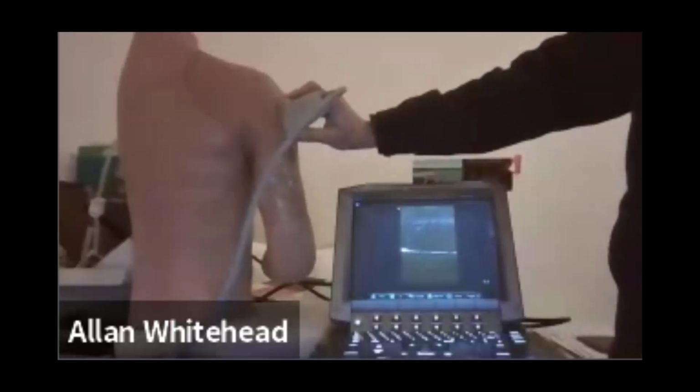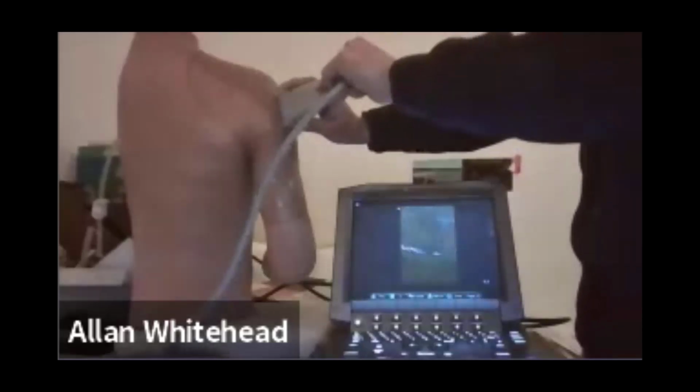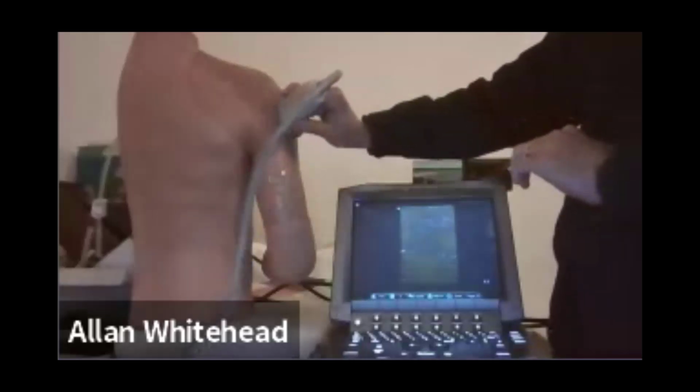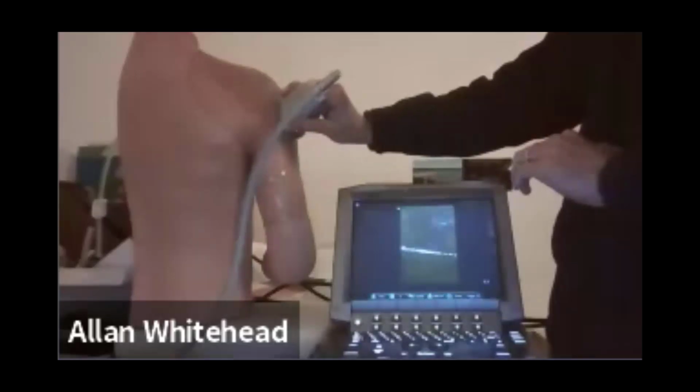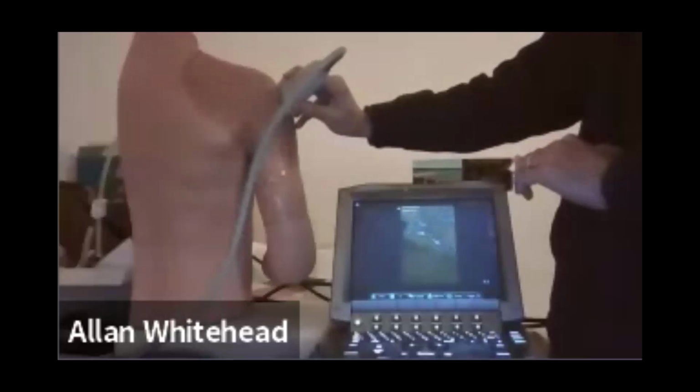without pushing the phantom over. So sliding up, it'll just look like an X-ray. So you slide up, sorry, lots of gel on this thing. I've come off it again, haven't I? So I've got to find my cortex again, it's a tricky bit. Okay, so there's the cortex, and I slide up, try and keep it nice and bright. It'll look like an X-ray. As you come up to the head, you get a nice round head. So this is the technique.